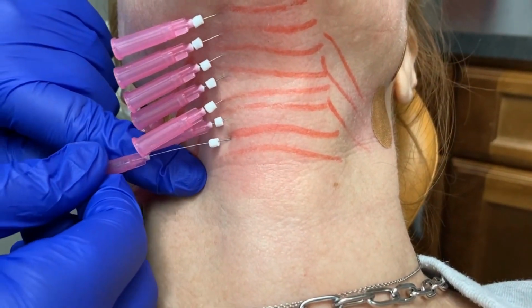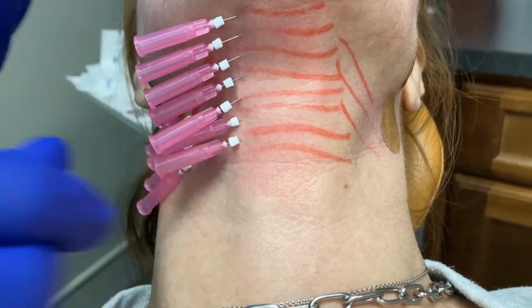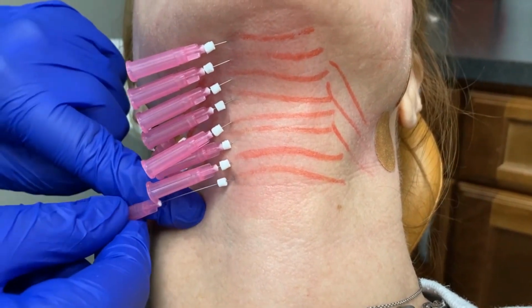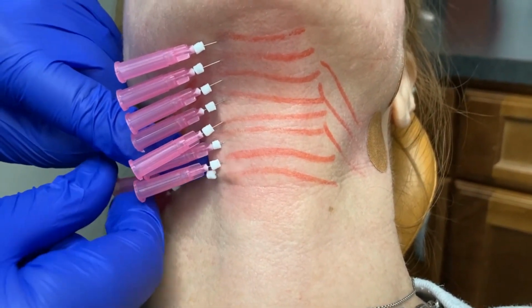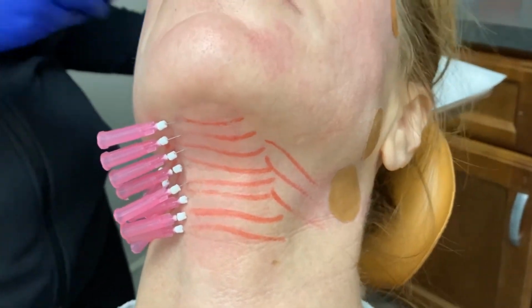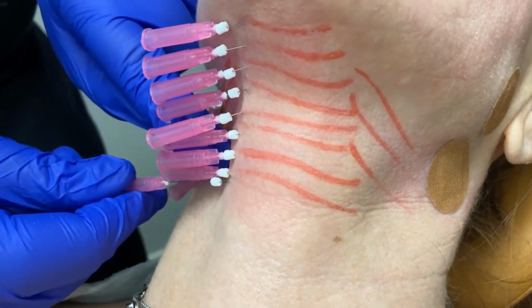And this is going to build that collagen and tighten everything while it's been pulled tight already with the lifting PDO threads. So you can have a lot of combo treatment in one appointment, which is amazing. Now, V-Soft Lift, these are the smooth PDO threads we are using. Why? They are the best. They are the best collagen producers.